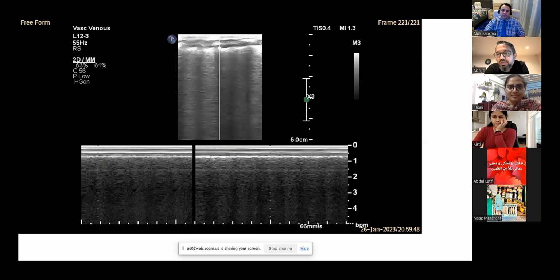for babies, 3 to 4 centimeters also does the thing, and you don't have blackout areas on the screen if you keep it at 3 to 4 centimeters. Here we don't see any blackouts or any fallouts of the image, but sometimes you do get in a situation like that.